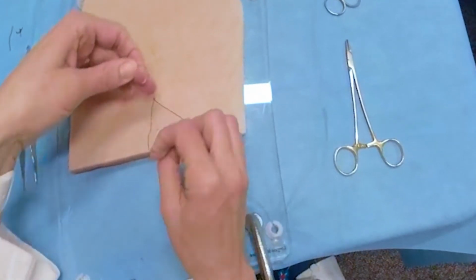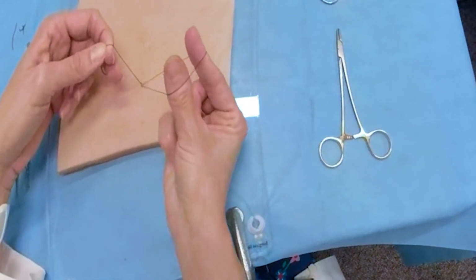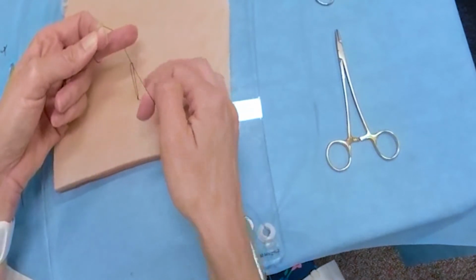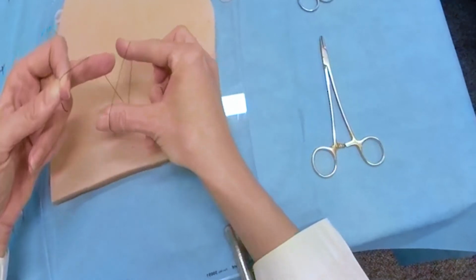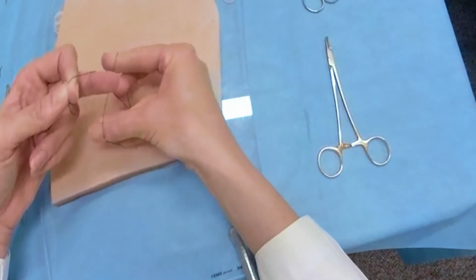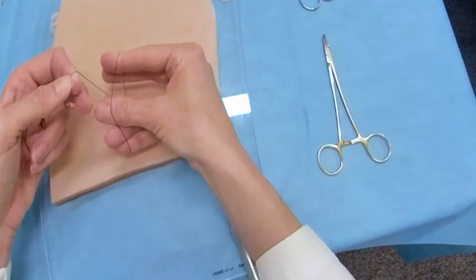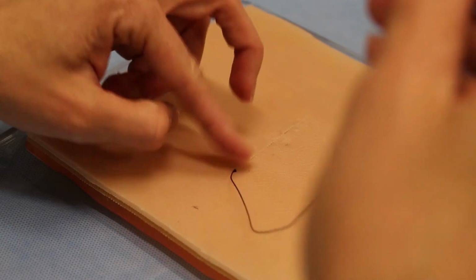So then we can do what we call a French knot. And I'll show you this and you can do it. We use 2 fingers to kind of make a loop here. We're going to grab this suture inside of the loop, and I hold on to the needle. I never let go of this. And I just pull the bottom part of it until it pulls that down. Hold this open, pull this through there, pull the bottom until it comes down. I'm going to do this about 3 or 4 times. And then when I've done 3 or 4 knots, instead of holding this the whole time, I'm going to pull the whole needle through that loop, and that's the end of my knot.